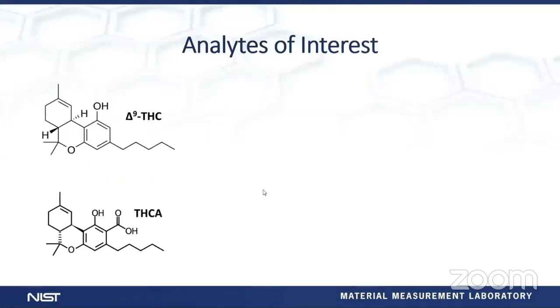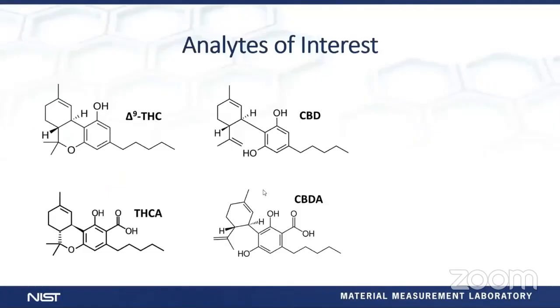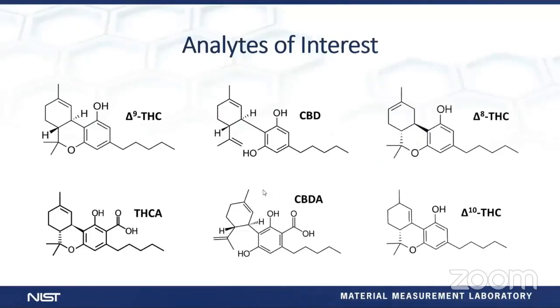In addition to delta-9 THC and THCA, forensic labs have a lot of interest in CBD and CBDA, as they are predominant analytes found in cannabis products, plant or finished products. However, more recently, there's been an explosion of delta-8 THC products and delta-10 THC products. These are two isomers of delta-9 that are believed to have some psychoactive effect. However, these two isomers do not generally exist at very high concentrations in the plant. Scientists have figured out a way to convert CBD into delta-8. That's why you see so many delta-8 products on the marketplace.